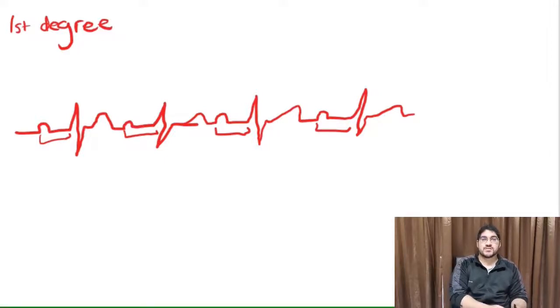The only thing you'll notice on a first degree heart block ECG is if you actually measure out the P-R interval from the beginning of the P wave to the beginning of the QRS complex and notice that it's more than five blocks, or you could miss it. Now the thing is, first degree heart block has a cause. It's not just there. And if you don't find it, it can lead to more serious complications. So you need to be able to recognize it.